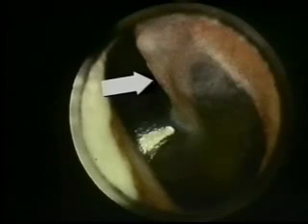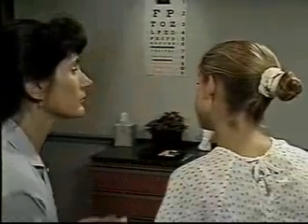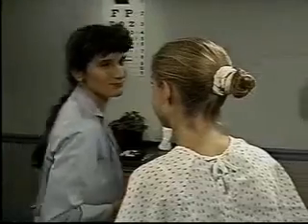Also note the position of the handle of the malleus and inspect the short process of the malleus. The handle of the malleus, with the umbo at its tip, crosses the drum obliquely from the cone of light upward toward the short process. Be sure to examine the other ear in the same manner.